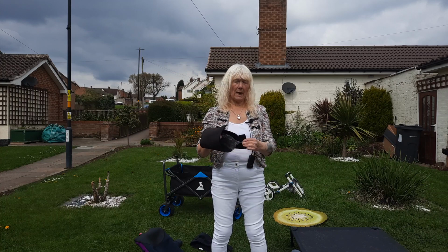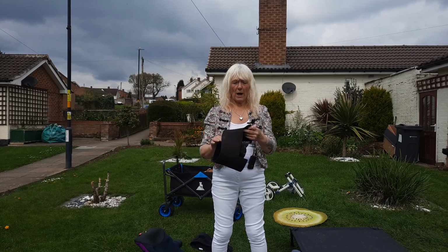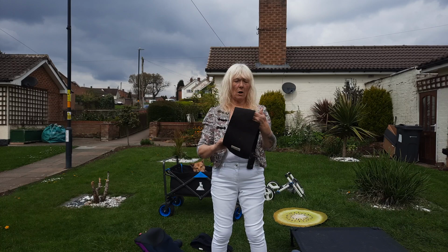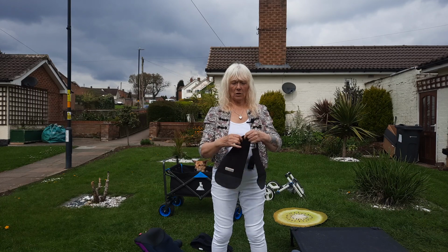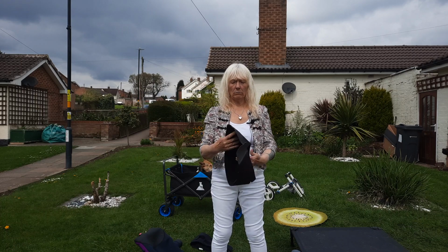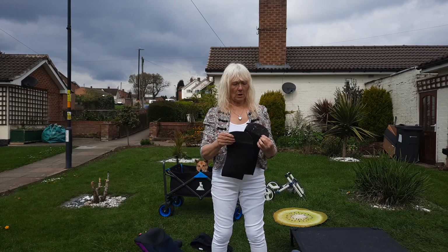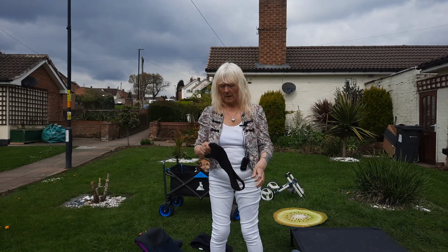So what we did, again, adapt your own accessories, adapt your own wheelchair. We just cut it out. So we cut that out around him and that was fine. And it doesn't mess at all with the structure. You can cut it and it doesn't fray. So that's just a little tip, you know, if you need to. So that's that. The walking wheels one.